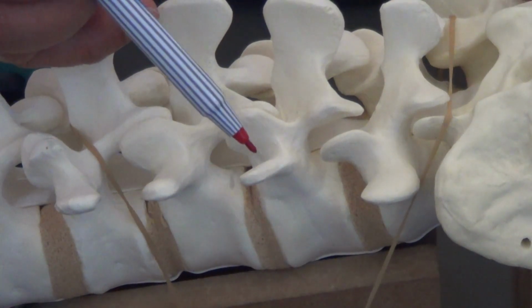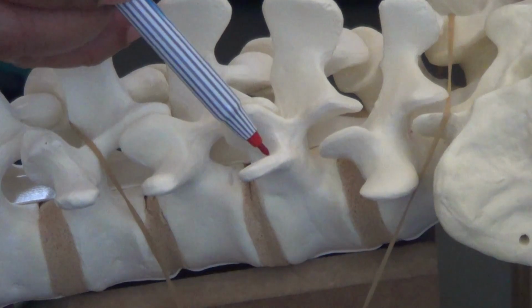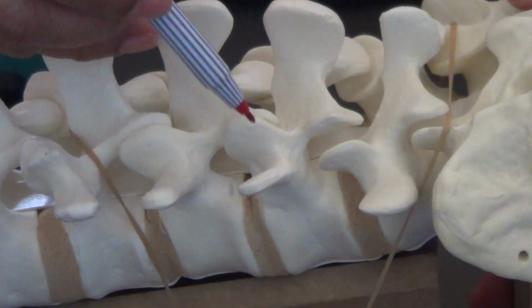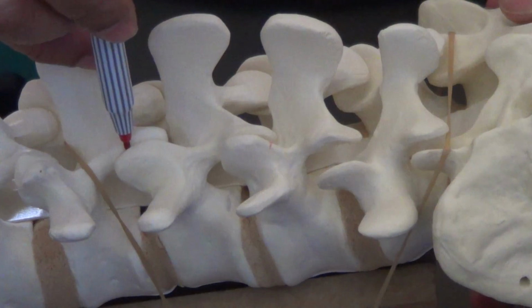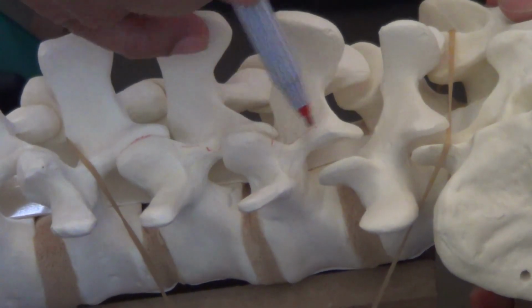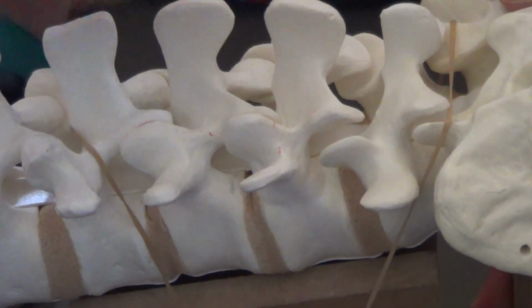Spine, the entry point is if you draw the midline of the transverse process. This is the classical entry point, and bring it up, and then you draw the line joining the two facets there, and where they meet, you enter, and then you go in.